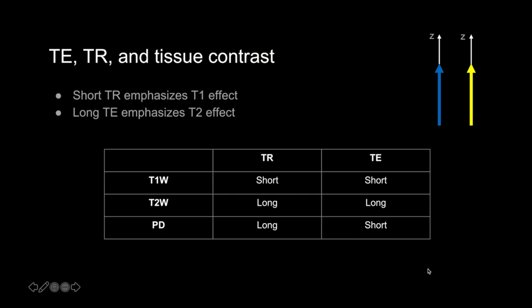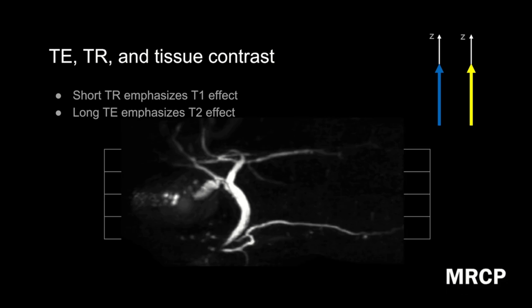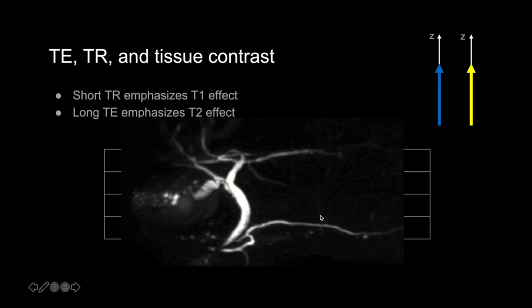Let's apply these concepts to something clinically relevant. This is an MRCP, or Magnetic Resonance Cholangiopancreatography image — a technique used to image the biliary and pancreatic ducts, helping us look for stones, strictures, tumors, etc. We're really trying to get a good look at the ducts: this is the CBD here, these are the intrahepatic ducts, and this is the pancreatic duct. This is an example of a thick slab MRCP image, and these are just very, very heavily T2-weighted images.